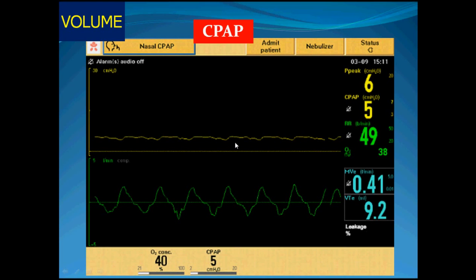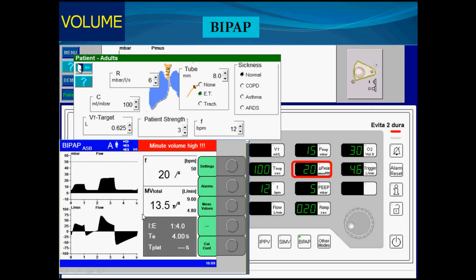Regarding CPAP, there is no driving pressure by the machine itself. All the workload is done by the patient, and the tidal volume is defined by the inspiratory drive of the patient. When you come to the BiPAP, if the patient is not taking his own breath, the tidal volume will be defined by the difference between the high CPAP and lower CPAP in face of resistance and compliance, and inspiratory time. This will define the tidal volume, but this is another one, which is the pressure support.